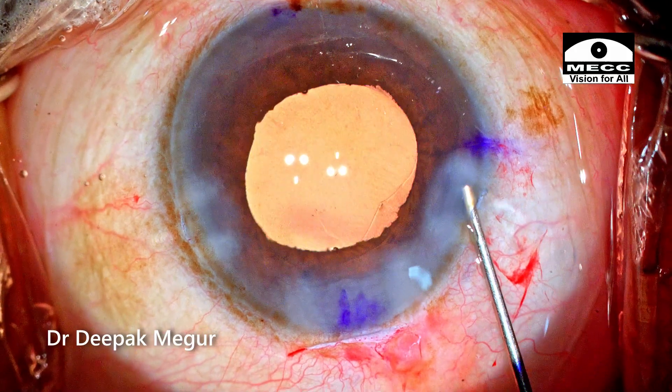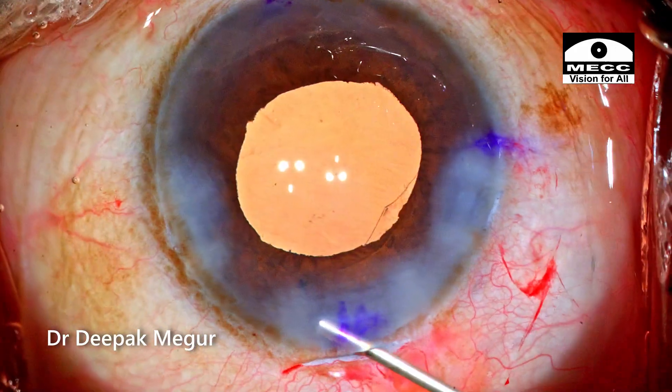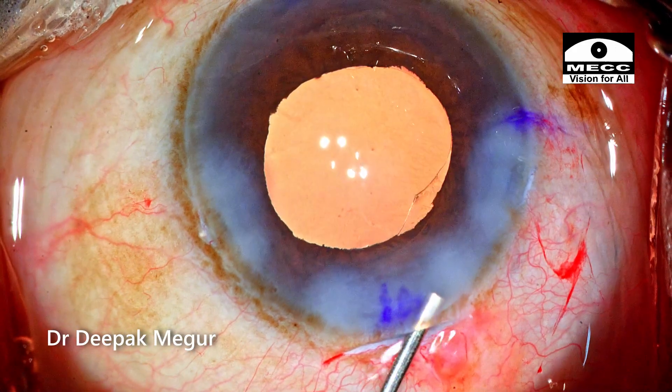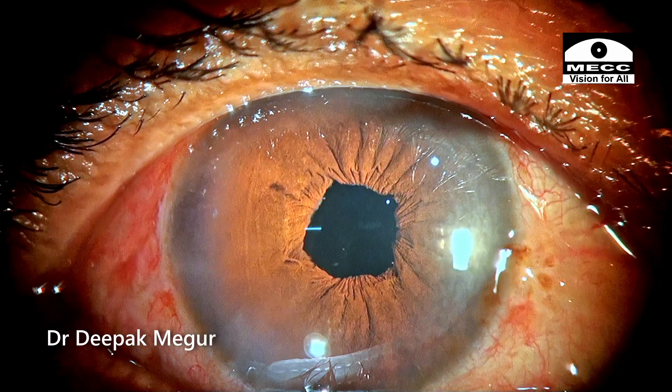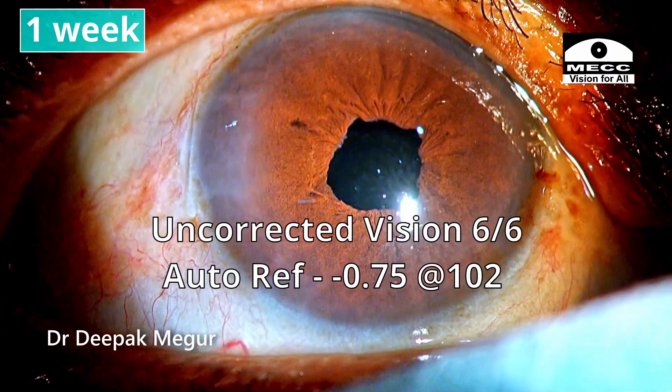The case is done. The side ports are hydrated. We can see the small sphincter tears — they're not going to be a major issue. This is how the first-day picture looks: the patient had an uncorrected visual acuity of 6/6. Thank you so much for watching and I hope you found this helpful.